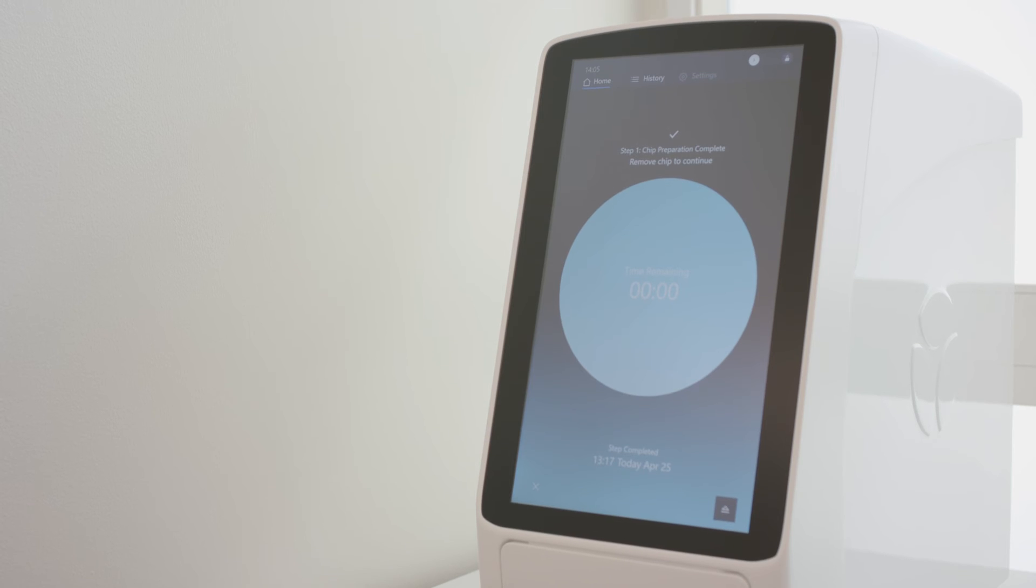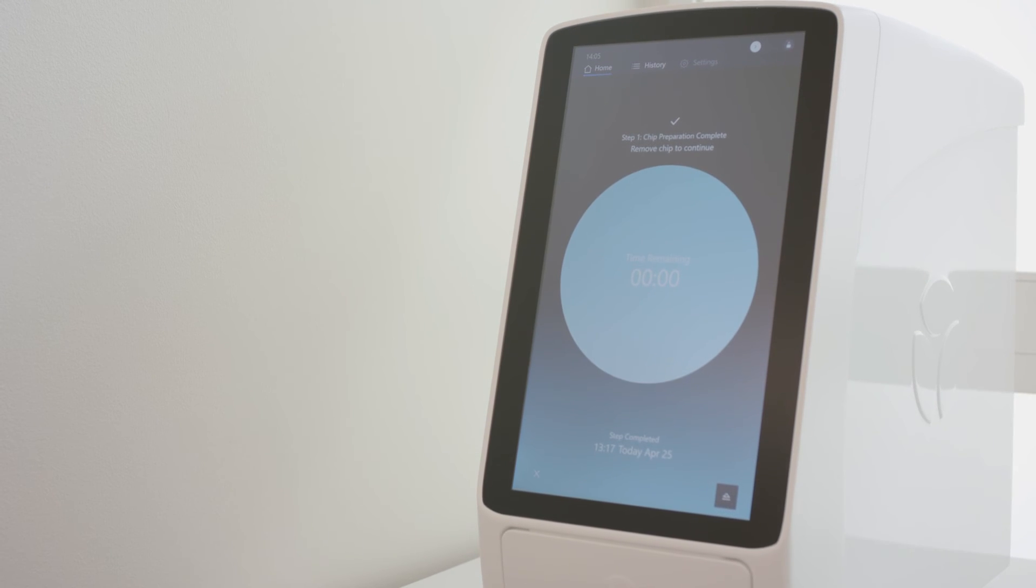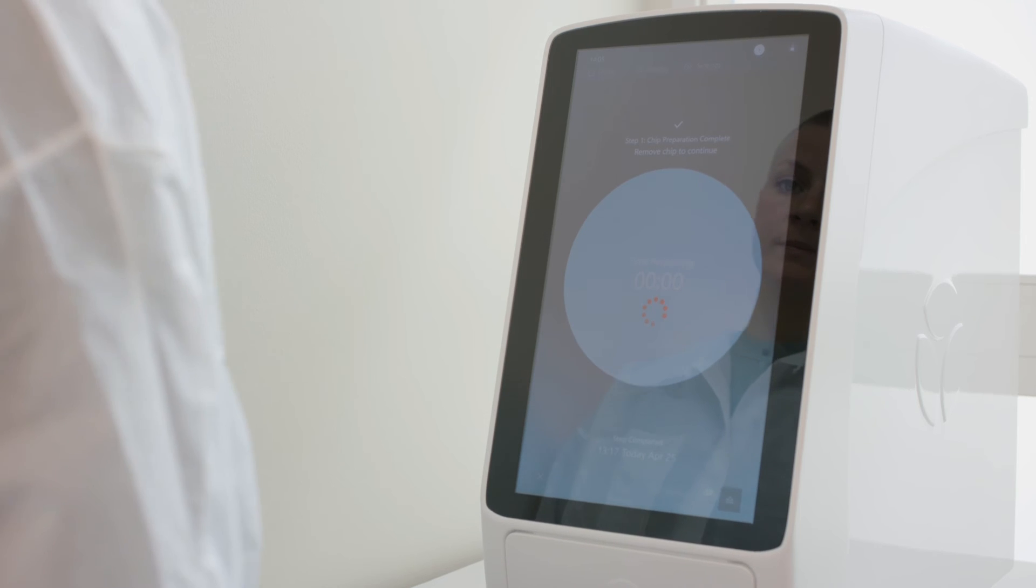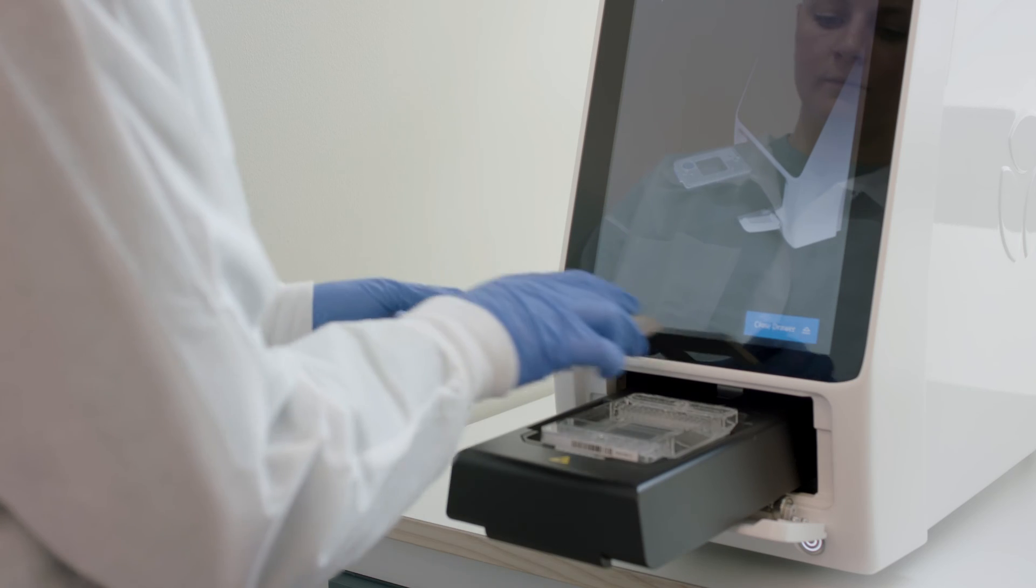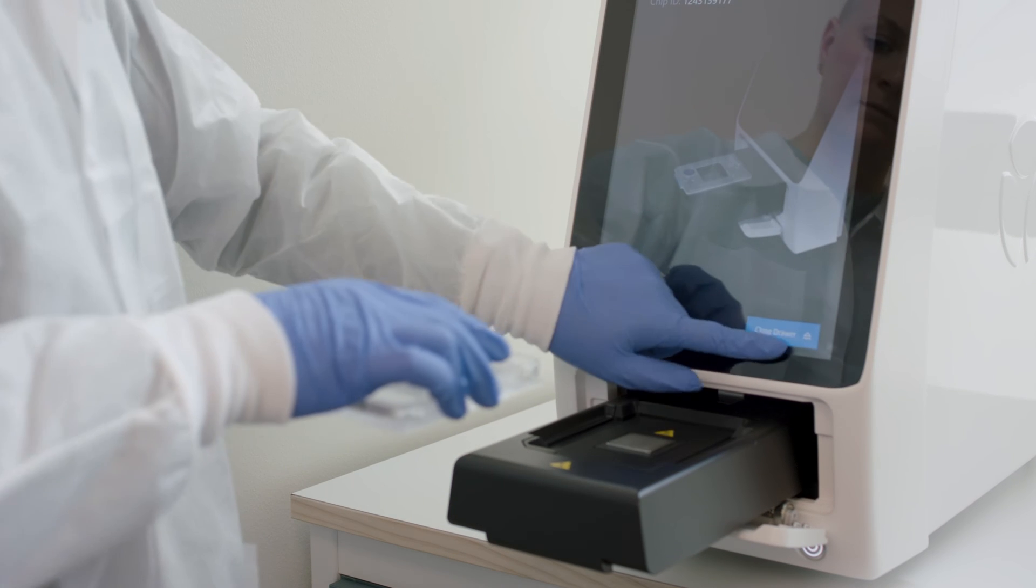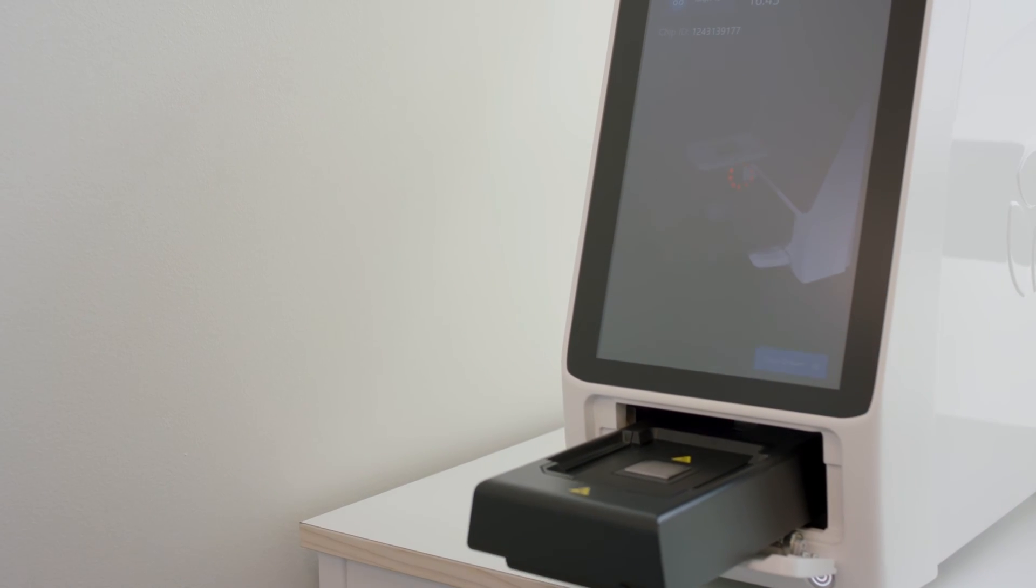The chip preparation is now complete, and the chip preparation complete screen is displayed. Tap the eject symbol to open the shuttle drawer and remove the interface plate and the IFC from the instrument. Tap close drawer on the screen. The shuttle drawer closes.